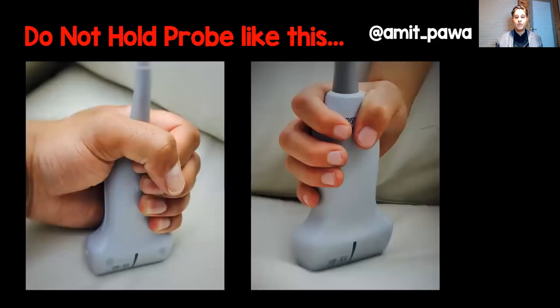Now, these are some old slides because the daughter that's pictured here is now 12 years old. So these slides are at least 6 years old. Don't hold the probe like this. I see people hold it like this. There's literally no reason for you to hold the probe like this.